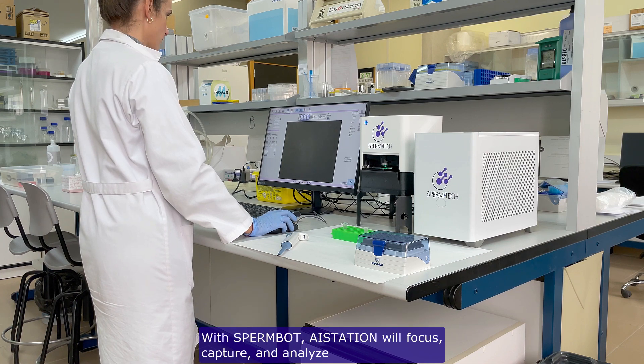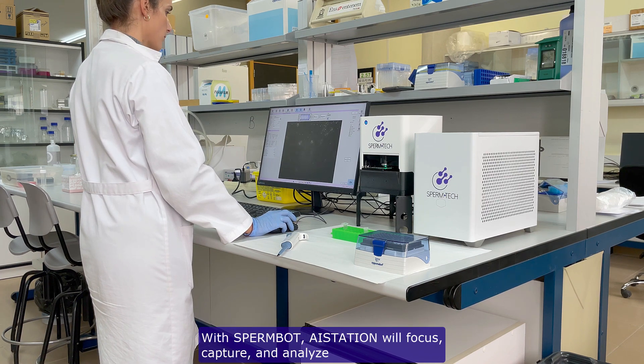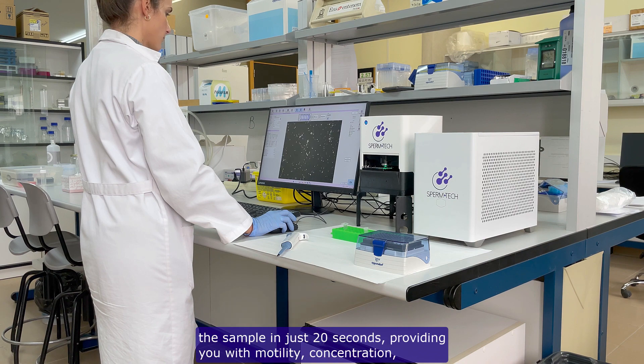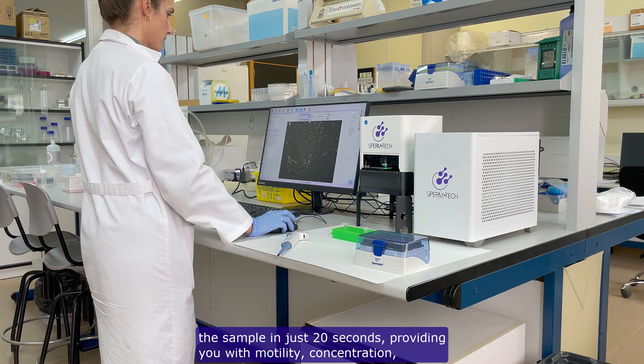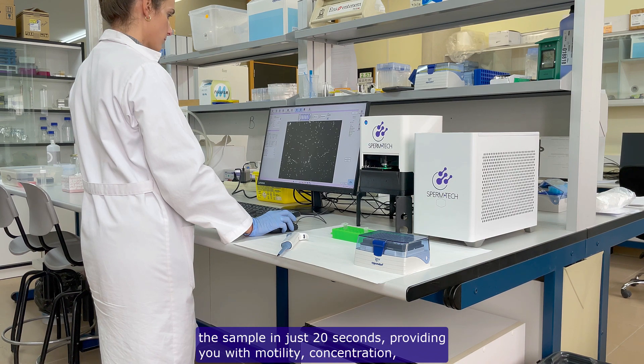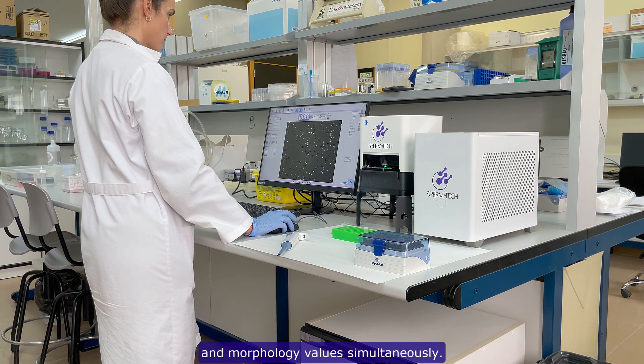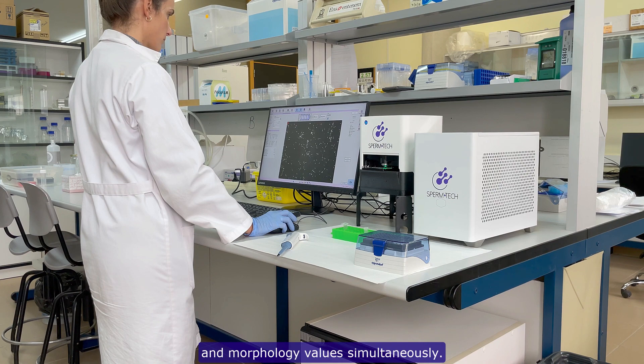With Spermbot, AStation will focus, capture, and analyze the sample in just 20 seconds, providing you with motility, concentration, and morphology values simultaneously.